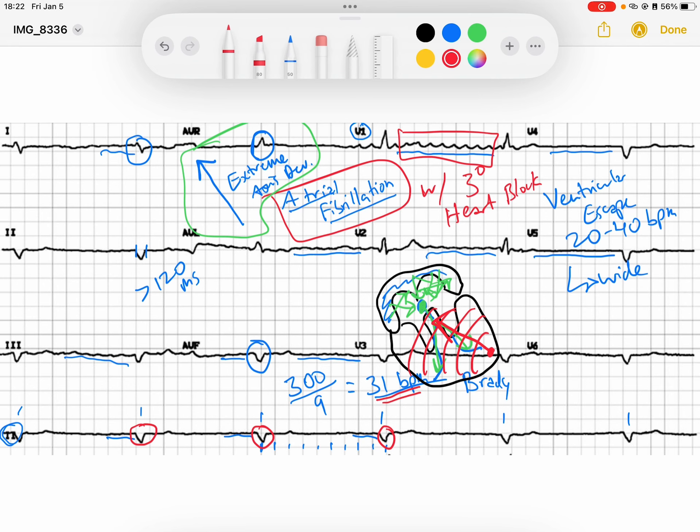So what's our rhythm? We've got atrial fibrillation with a third degree heart block. This person is in deep, deep trouble and they need a pacemaker ASAP. I hope this helps — have a great day.